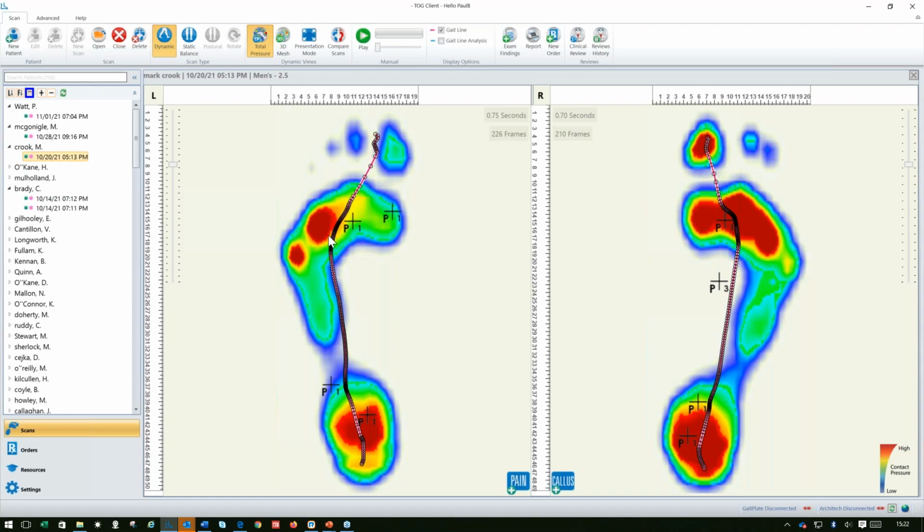And that's normally an indicator that first MTP joint's not functioning properly. So if it can't bend, we can't pivot within the normal sagittal plane. So we twist and we rotate through transverse plane. You will see this all the time. You will see this in patients when they're walking because they'll have a little bit of an abductory twist in their foot, or you'll see their pelvis, they've got a little bit more of a transverse rotation or a wiggle, so to speak, as they walk. You can see their pelvis rotates a little bit more.